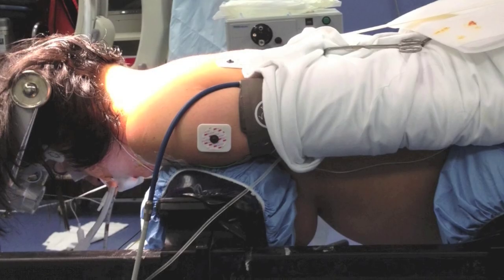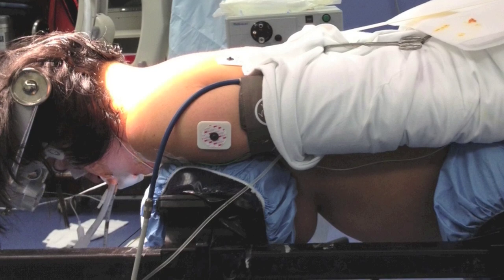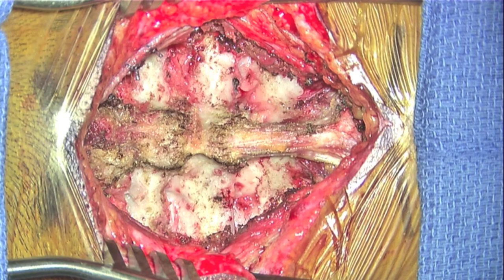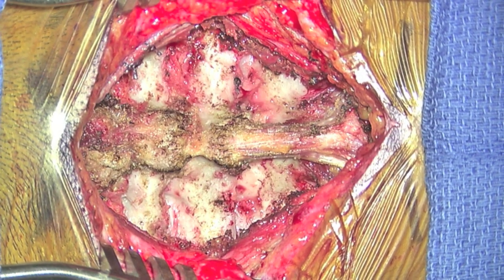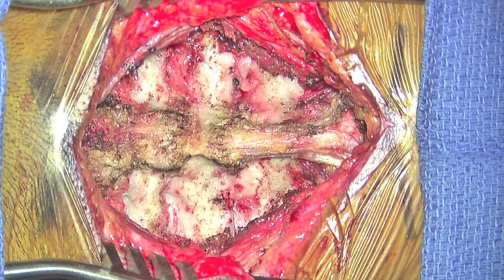This will allow us to keep the abdomen free from any pressure and maintain the neck in a fixed, stable position for tumor resection. A midline skin incision and bilateral subperiosteal exposure of the cervical spine is accomplished from C2 to C5 that extends just beyond the lateral margin of the C3-4 facet joint. The head is to the left.